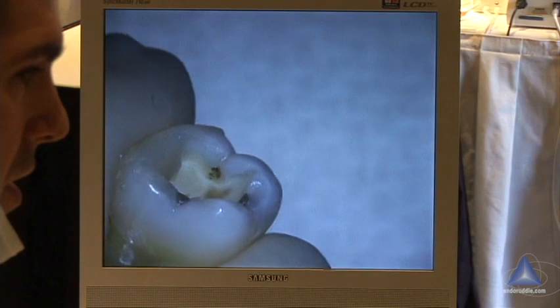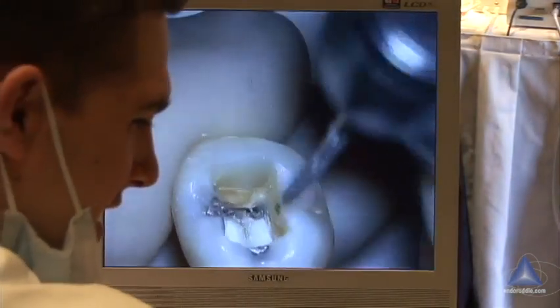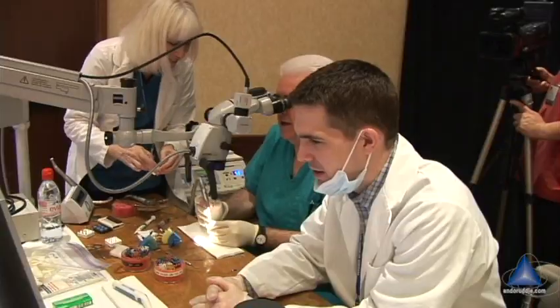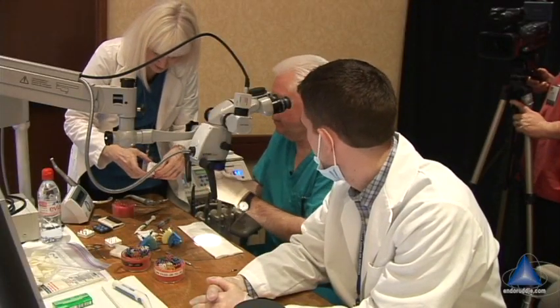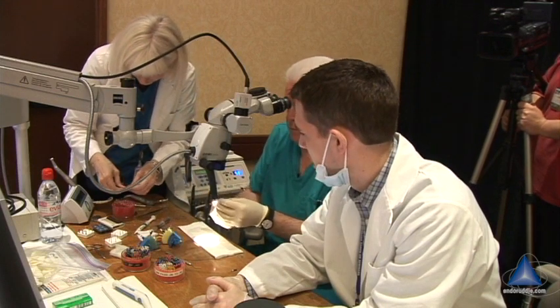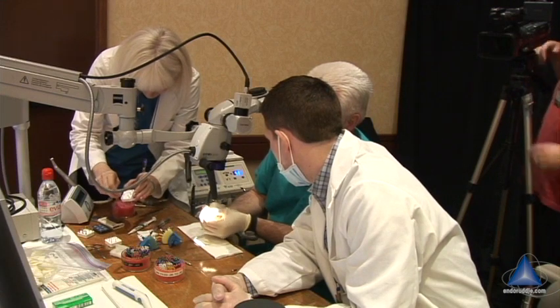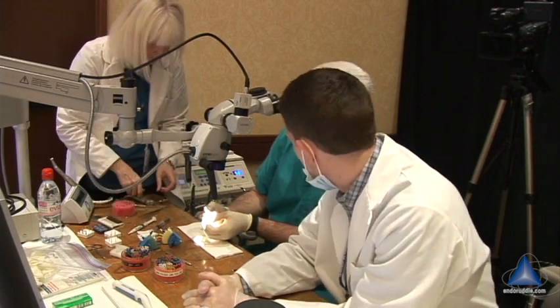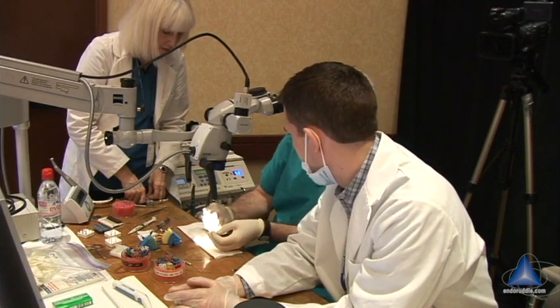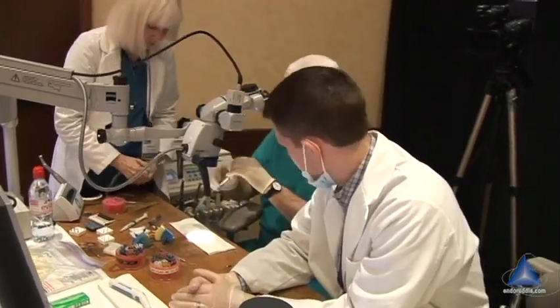What do you need? Maybe this one or maybe even a different one. I have skinnier ones. Maybe a different one — I'm constantly guessing. Here's a trick: seat it and then pull it out as far as you can as long as it runs centric. Because if you extend it, you kick the head of your handpiece further away and now you get lines of sight.